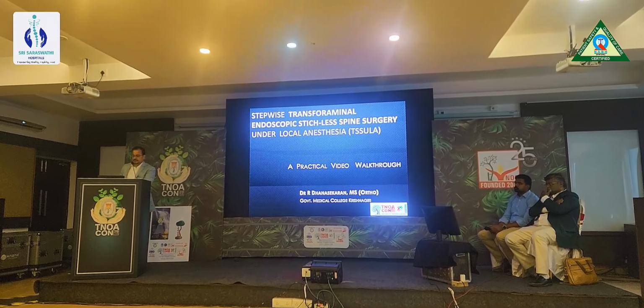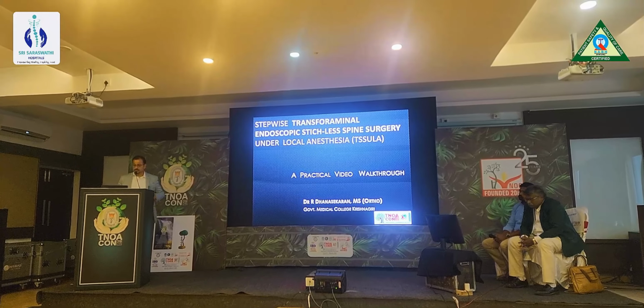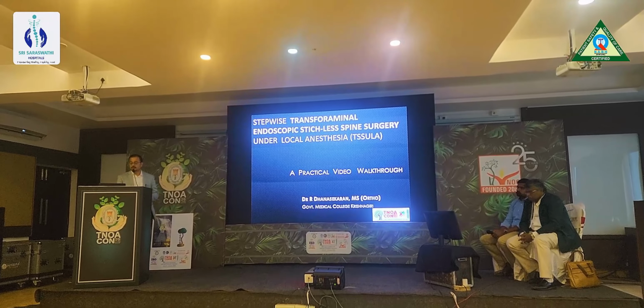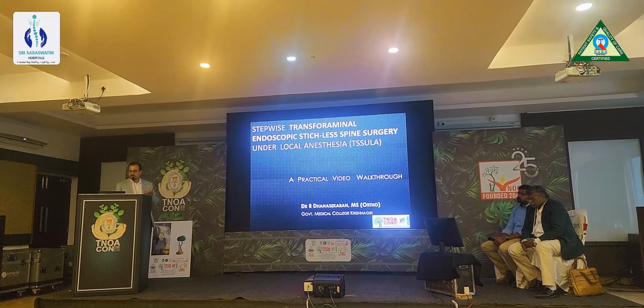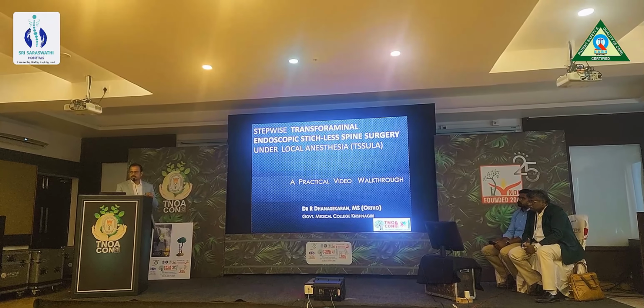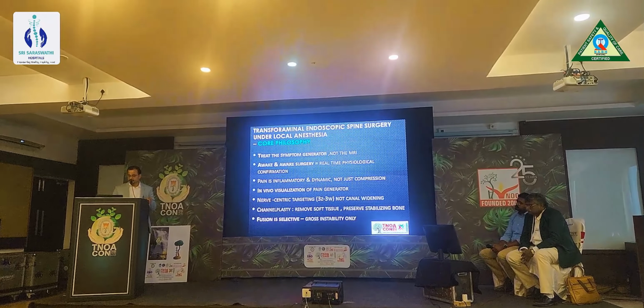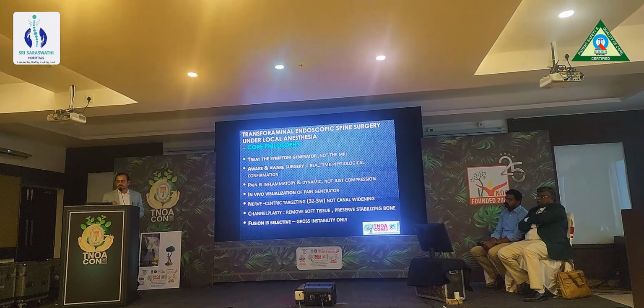Chairpersons and my dear friends, today I am going to talk about step-wise transforaminal endoscopy, stitchless spine surgery done under local anesthesia, focusing mainly on the workflow of the procedure and the safety as well as clinical endpoints. The core philosophy is simple: treat the pain generator.